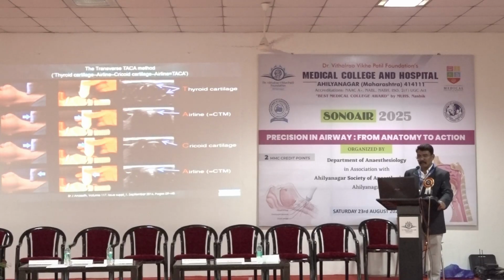Then if we see the airline behind the cricothyroid membrane, this can be used as a tool for cricothyroid puncture in emergency airways.